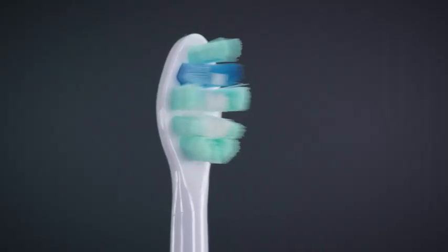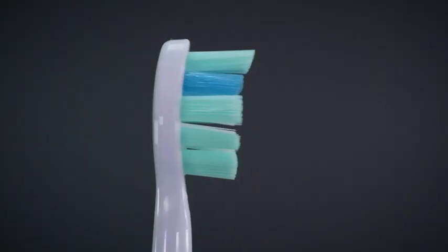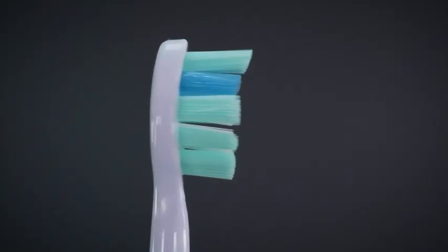The oval-shaped brush head is larger than some other brush head styles and generally makes contact with a couple of teeth at a time. This can potentially make brushing slightly more difficult in smaller or more cramped sections of the mouth. The C2 head does boast a curvature to the tip of the brush head that helps reach the very back teeth.